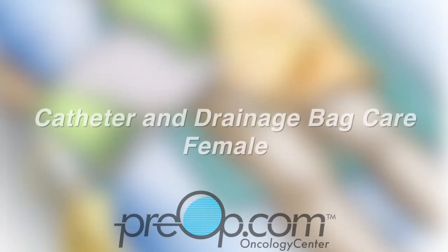You have a Foley catheter in place to drain urine. This video will help you to understand how to care for the catheter and the drainage collection bag.